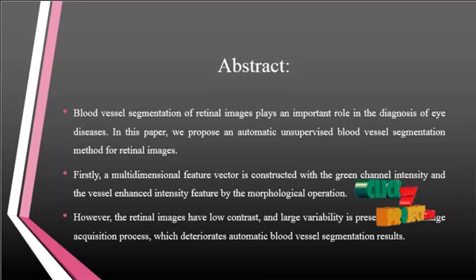After the multiscale filtering via the LID and the LAD domain, the results are projected onto a 2D plane, and the enhanced vessel regions are segmented by use of morphological operations. Blood vessel segmentation of retinal images plays an important role in the diagnosis of disease. So in this paper, we segment the blood vessels present in the retinal regions, using the morphological segmentation method with the green channel intensity and the vessel enhanced image features.